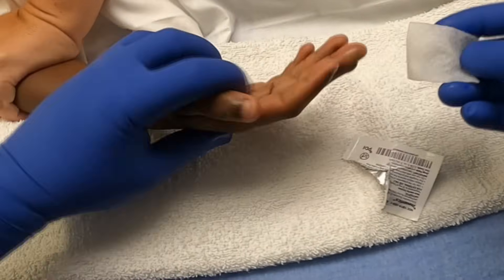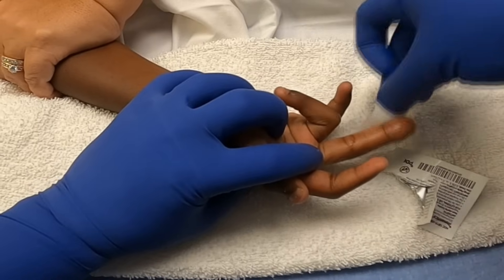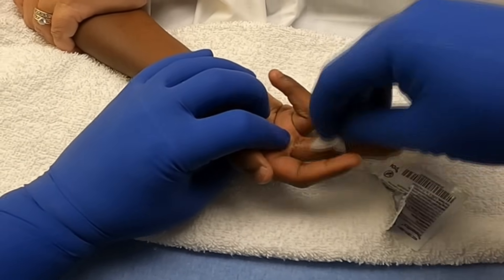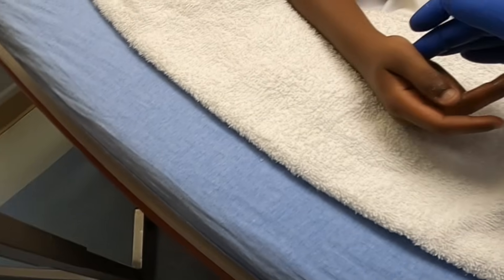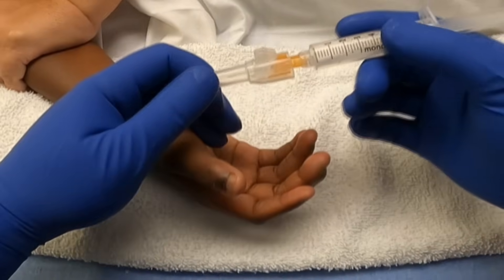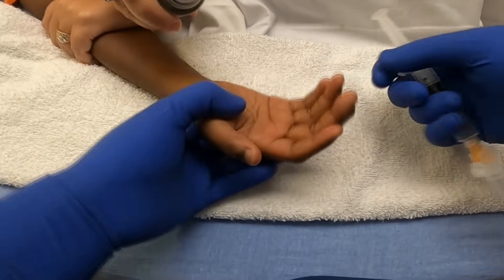Once we've cleaned off the area, we'll flip the hand over and also clean off the palmar aspect of the digit so that we can do our block. Once the block is done, we'll be able to drain with a lot more cooperation. For the block we're going to use one percent lidocaine without epinephrine, and prior to injecting we're going to use some pain ease spray.